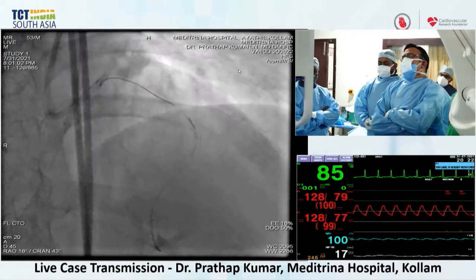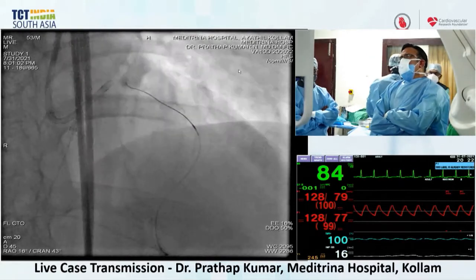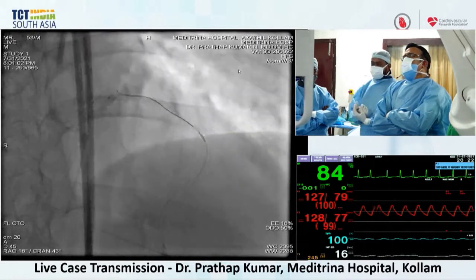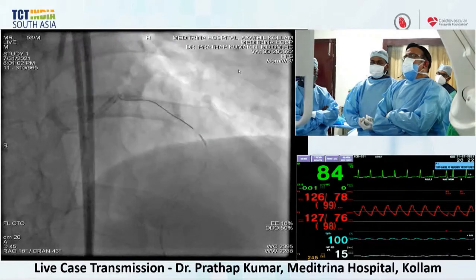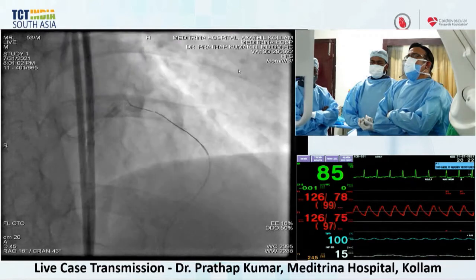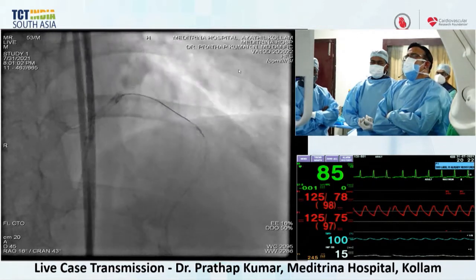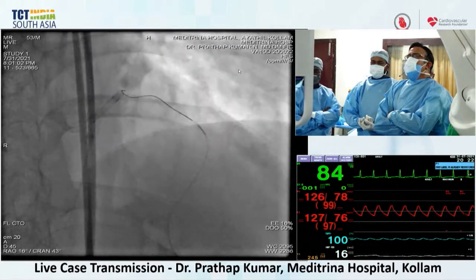I did not take any antegrade wire till now because there was no need. Now I understood it's a roomy one. I made some changes in my wire positioning and the catheter. I think next, same thing. Yeah, oh, it was a long fluoro store.